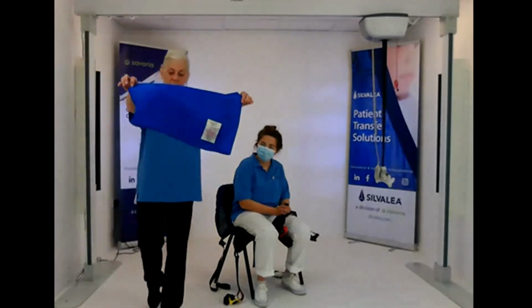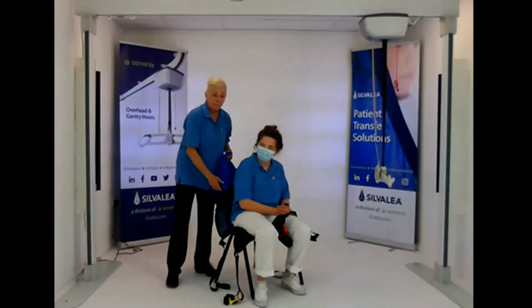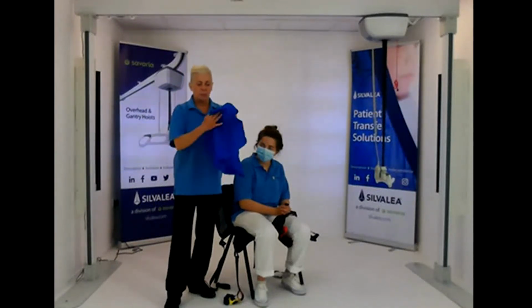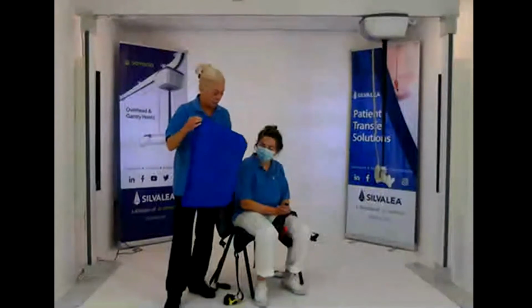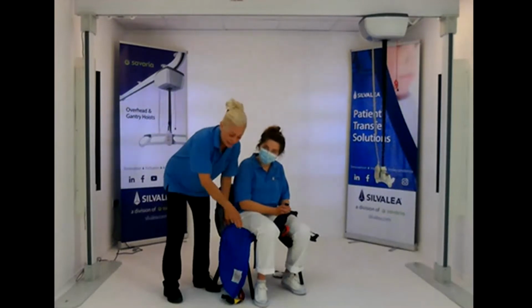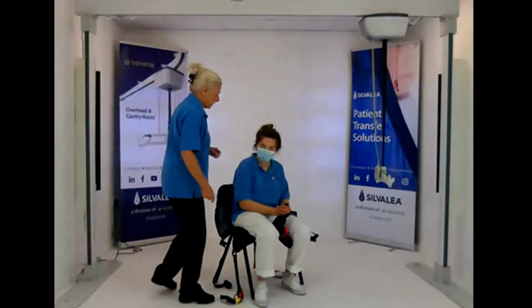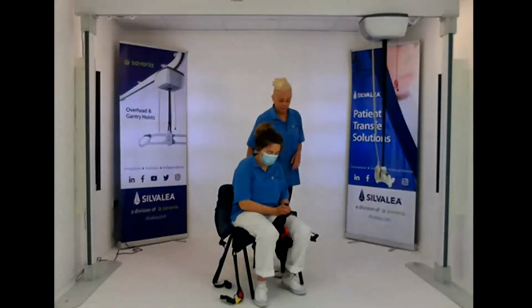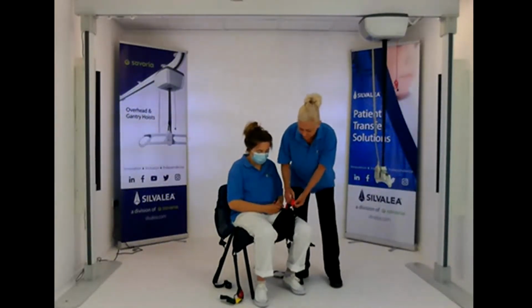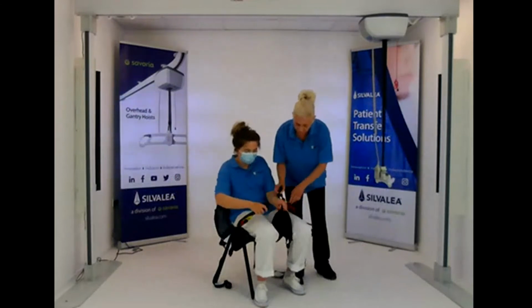Or slide sheets that you can use as a roller to insert to help get the sling in. Various sizes. This is a small rolling one, cylinder one. We do flat ones as well, but really helpful. The little ones particularly help with getting the sling smoothly underneath so that you're not shearing too much. So there's always lots of tips that everyone can share to help with making it an easier experience. But the leg sections come through and connect together with this modesty here, and then the outside tape feeds through.